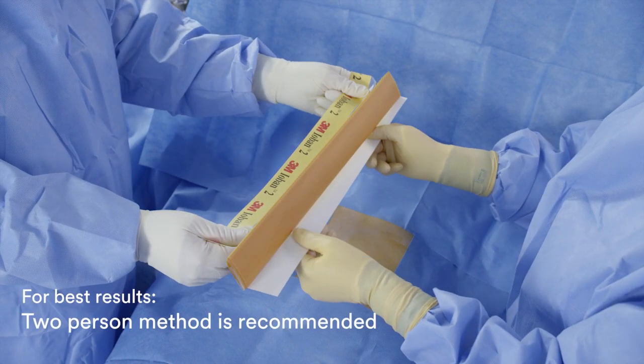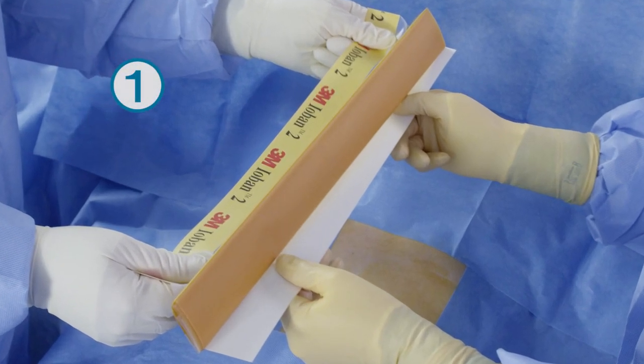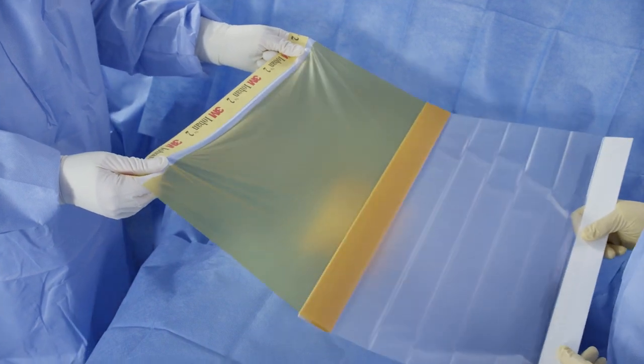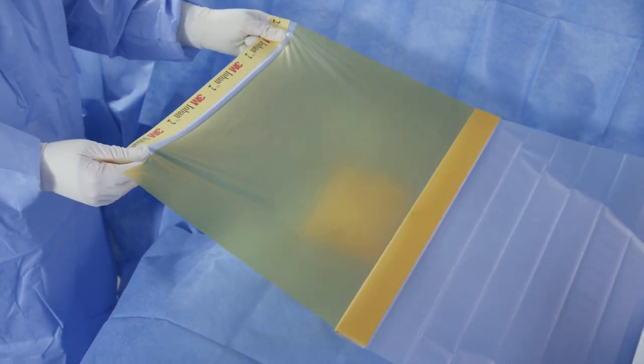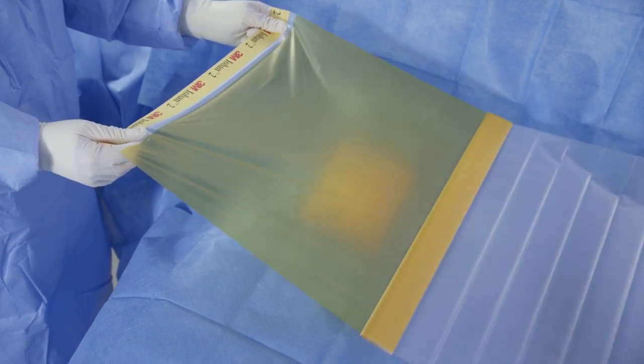For best results, a two-person application is recommended. Standing on opposite sides of the patient, person number one holds the printed drape handle with the printed side up above the patient's body. Person number two separates the printed handle from the white edge liner and pulls the white edge liner evenly away from person number one. When unfolding the drape, both persons should place hands on the outer corners of the edges to keep slight tension on the drape and keep it as wrinkle free as possible.